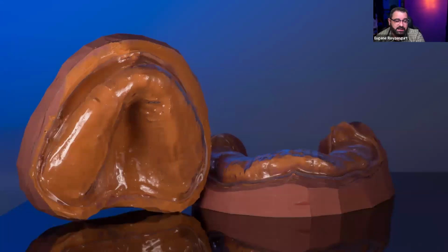And then I processed the case and created some alveoloplasty guides. Back then, the way I used to do alveoloplasty guides, and if you guys are still doing analog, this is an easier way to do it. You basically take a putty impression of the inside of the denture, and then you do like a surgical guide suck down on top of that. That gives you a really nice alveoloplasty guide for the doctors to do bone reductions. And this is what she looked like after surgery. So not bad, but there's a lot of risk involved in something like this.